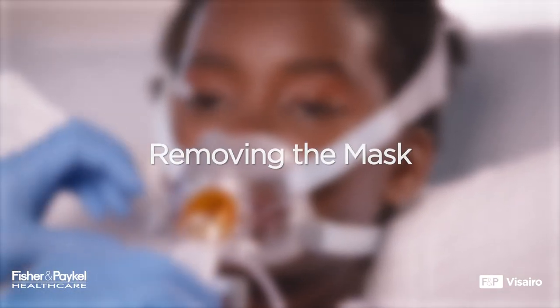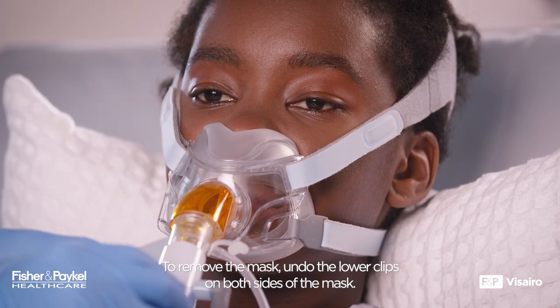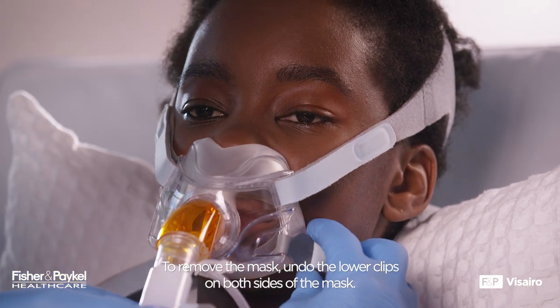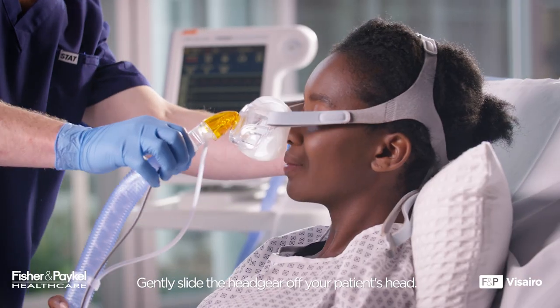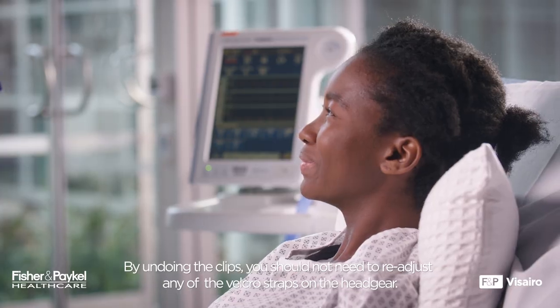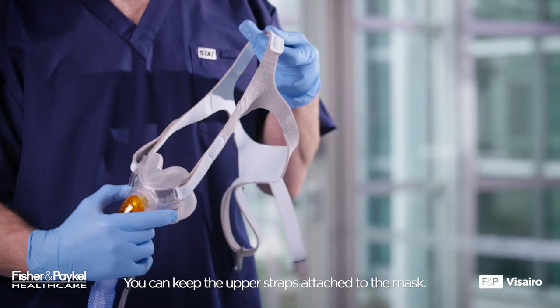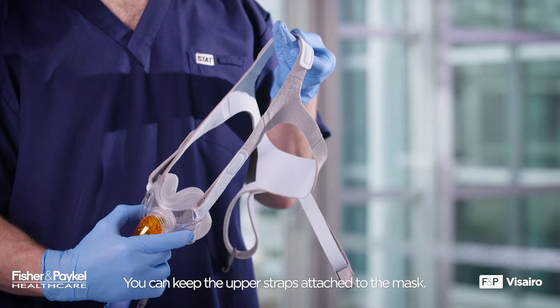Removing the Mask. To remove the mask, undo the lower clips on both sides of the mask and gently slide the headgear off your patient's head. By undoing the clips, you should not need to readjust any of the velcro straps on the headgear. You can keep the upper straps attached to the mask.